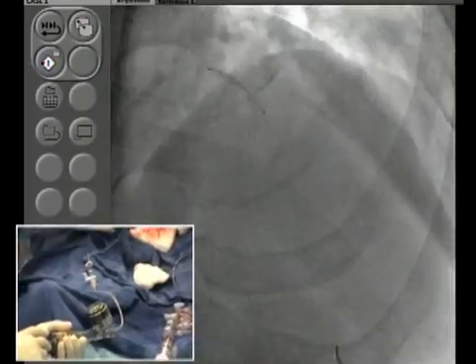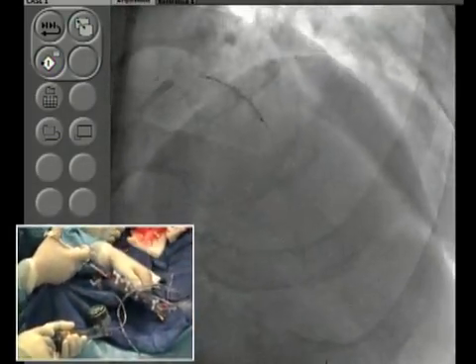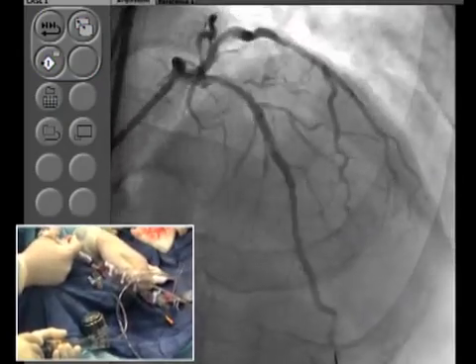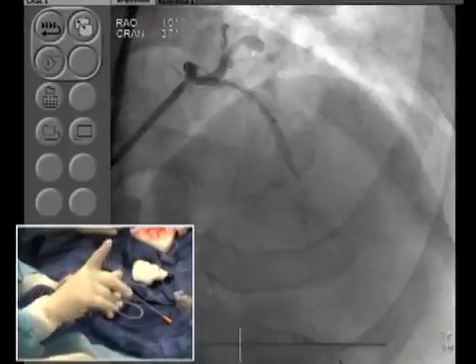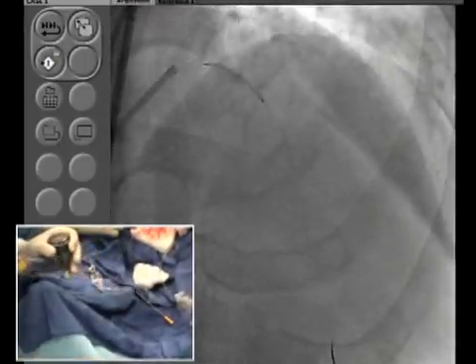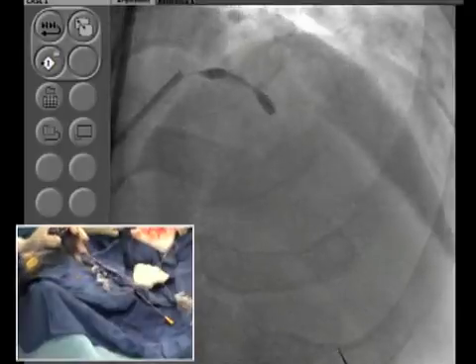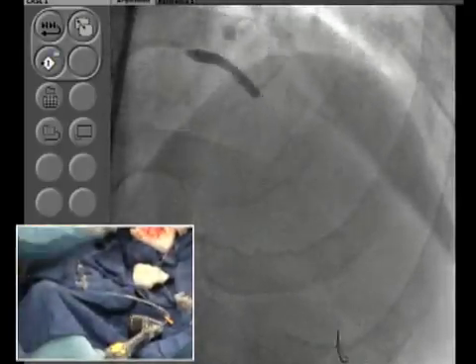Samin, there is a question by a Dr. Ghazi Malik. I don't know the origin of it. I'm going to read it exactly because I want to capture what he's asking. What torque setting of the rotablator are you setting? Okay, I'm sorry, say it again. What torque setting of the rotablator are you setting? RPM, you mean? I think he basically means RPM. Yeah. So that was 150,000 RPM outside the body, and in the vessel about 140.